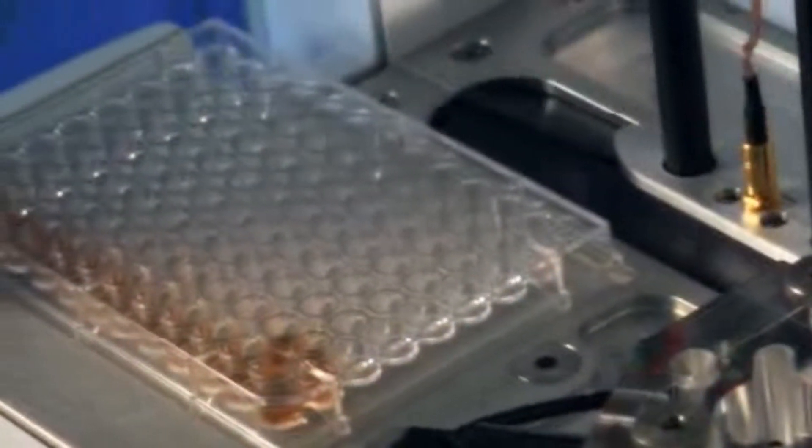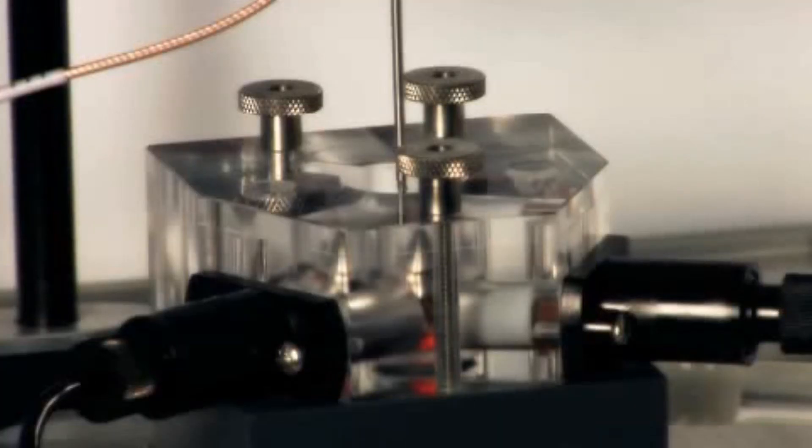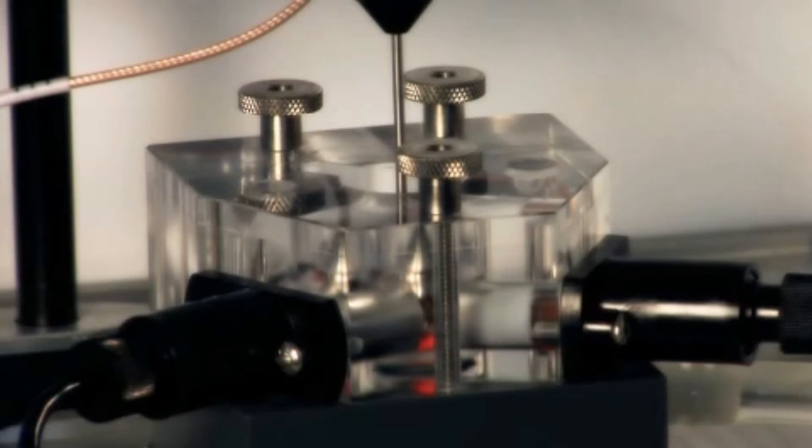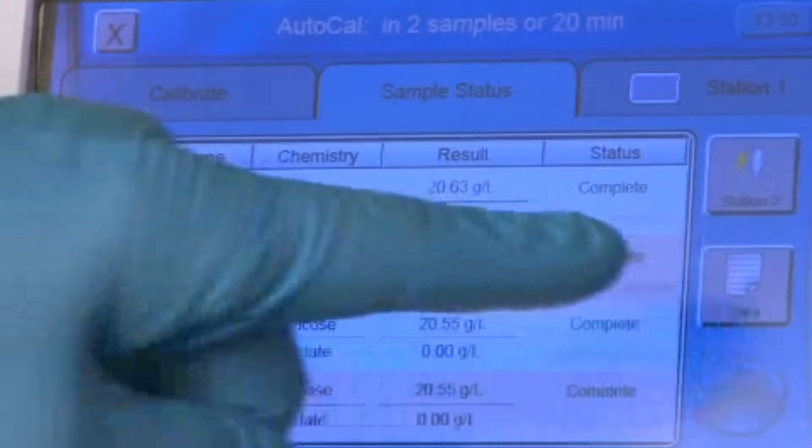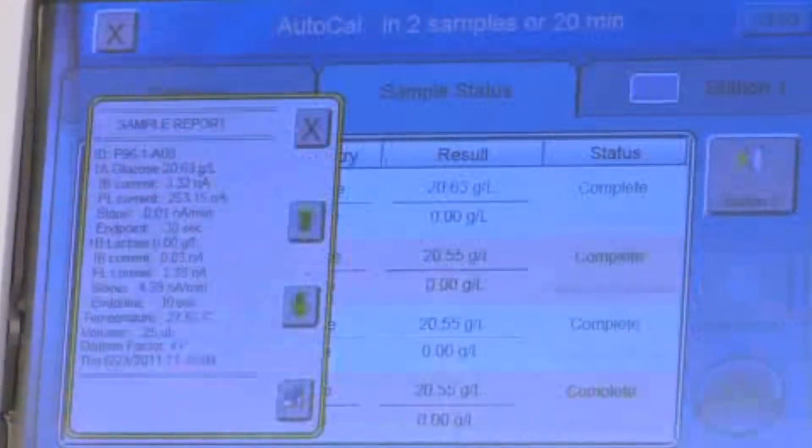The YSI 2900 then aspirates the selected sample volume, dispenses it into the chamber, allows a few seconds for the enzymes to react with the sample, and measures the resulting peroxide concentration with a Clark electrode. Immediately, the sample is removed, the chamber is flushed, and the rinsed injection tip returns for the next sample.